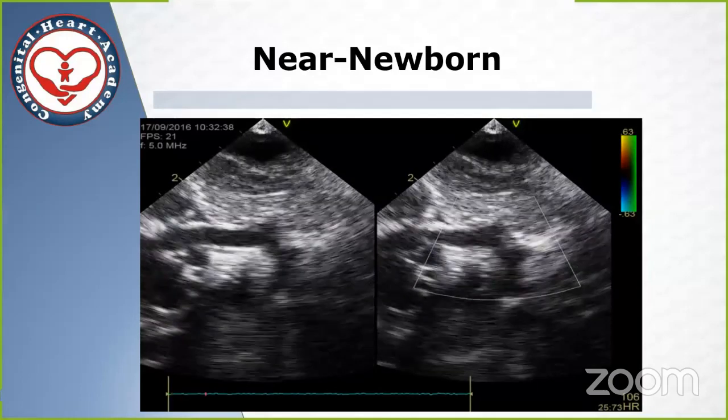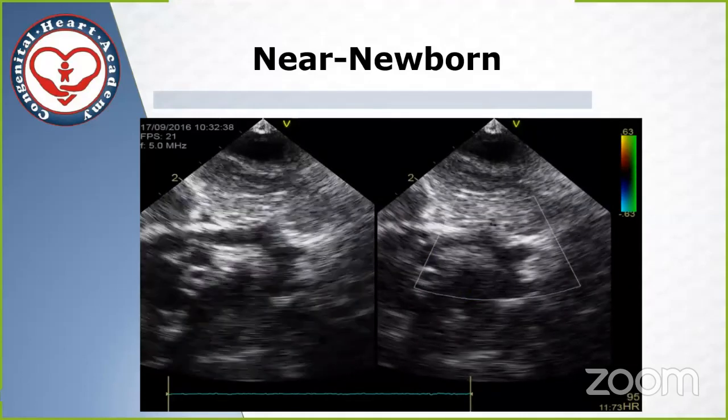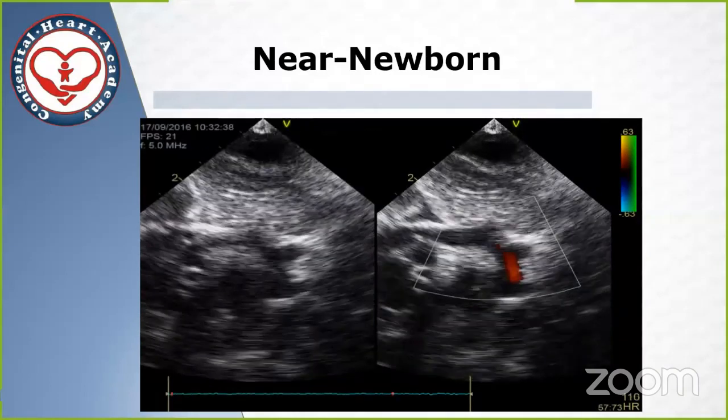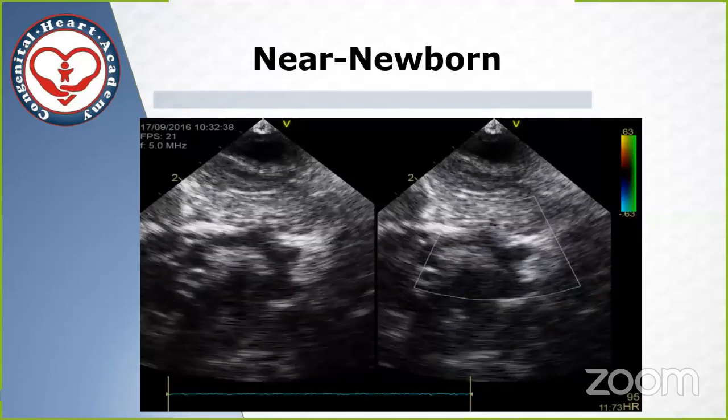So we have to move one step forward and look at the anatomy and the arch anatomy on our postoperative patients. In this view, there is an obvious flow, a red flow returning from the arch. That means that there's a severe coarctation or a severe arch interruption.